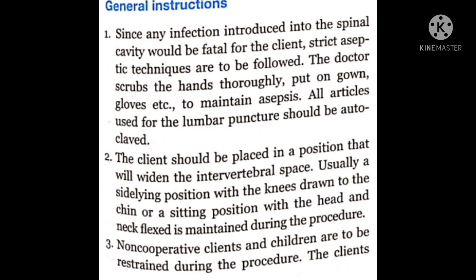General instructions. 1. Since any infection introduced into the spinal cavity would be fatal for the client, strict aseptic techniques are to be followed. The doctor scrubs the hands thoroughly, puts on gown, gloves etc. to maintain asepsis. All articles used for the lumbar puncture should be autoclaved.